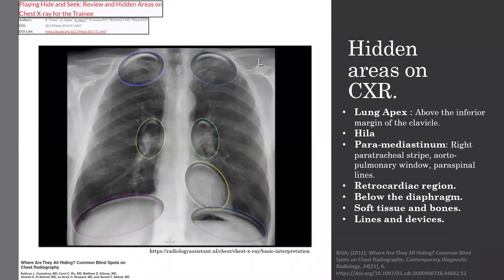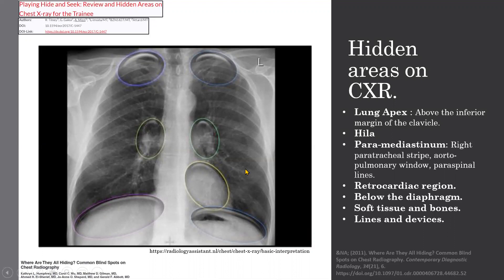There are certain areas on the chest x-ray that tend to go overlooked by reporting radiologists, called hidden areas or blind spots. These include the lung apex, the hila, the paramediastinum, the retrocardiac region, below the diaphragm, soft tissues, and lines and devices such as pacemakers and central venous catheters. It's important to reassess these areas before a final report is given, as lesions tend to be hidden there.